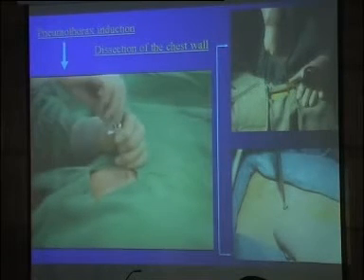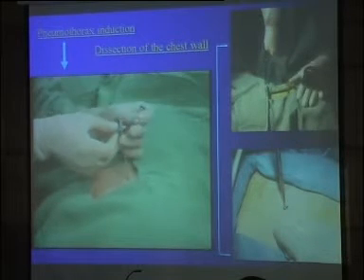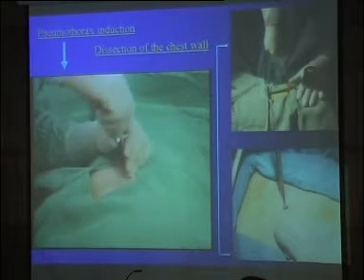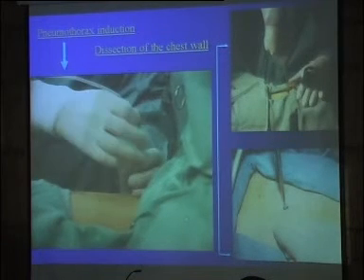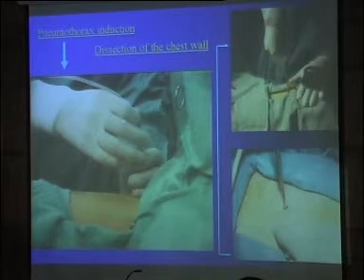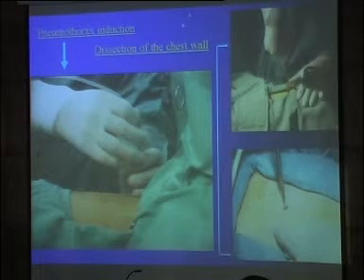As you can see here, you put the needle inside, and we replace the mandrin with a pointed tip by the blunt one to go through the pleura, and then we open and the air comes in. You can check the intrapleural pressure with a simple device. You connect the needle with this catheter, and you have at the end a kind of centimeter scale to see the pressure. We can discuss this point if you want.